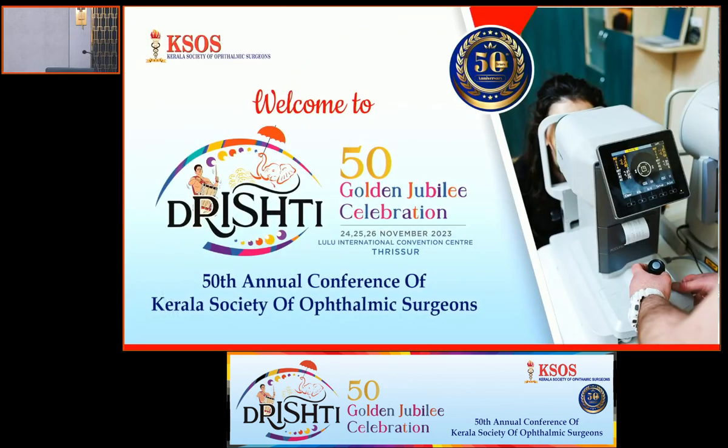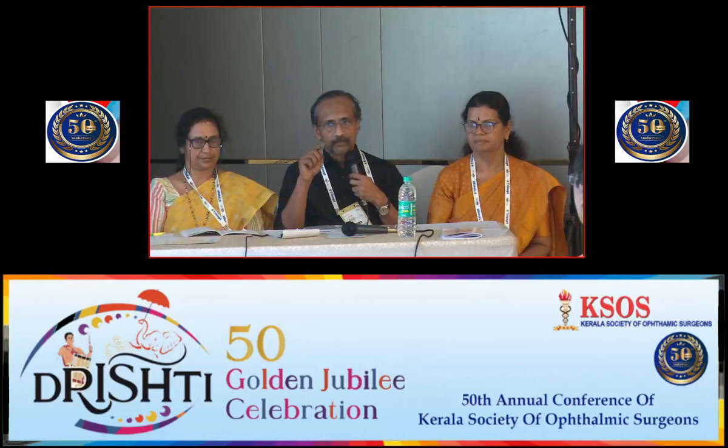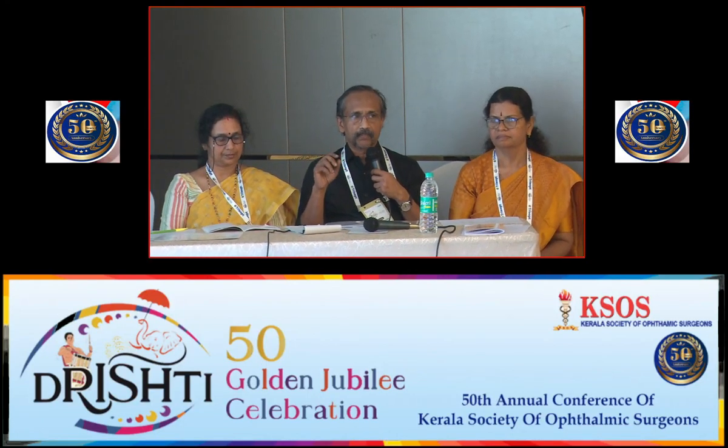Very nice, Dr. Dahlia. Yeah, soft contact lens, even though we all practice, there are a lot of small things which are very relevant. And as she rightly said, the lens should be centered well, moving a little when you are blinking. And you should also observe under the slit lamp whether any blood vessels at the limbus are being pinched by the contact lens.